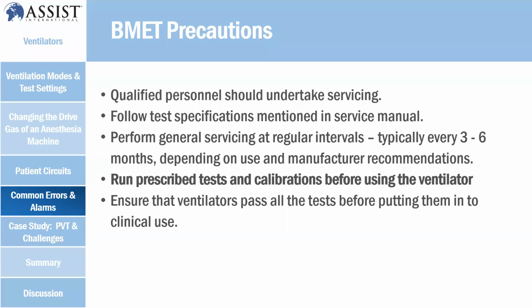So you need to know your method of checking, and perform general service at regular intervals, typically every 3 months or 6 months, depending on the use and manufacturer recommendation. Because these are critical equipment, it can go under service every 3 months or 6 months, depending on the condition.